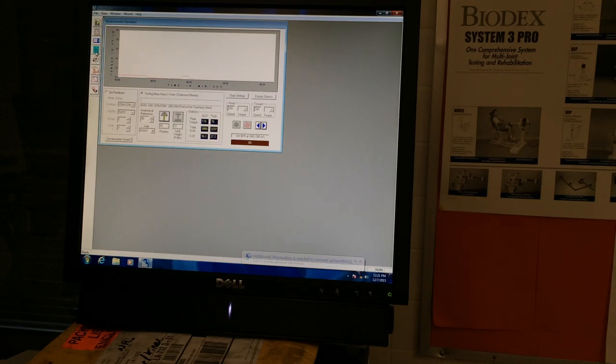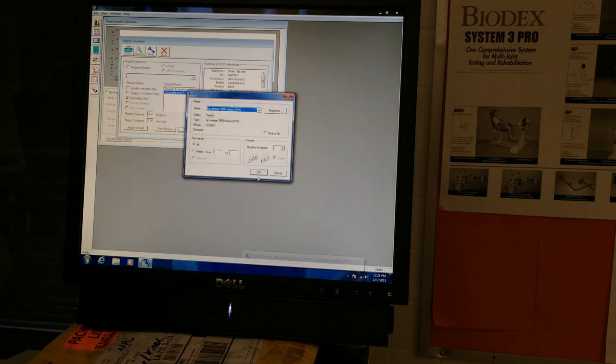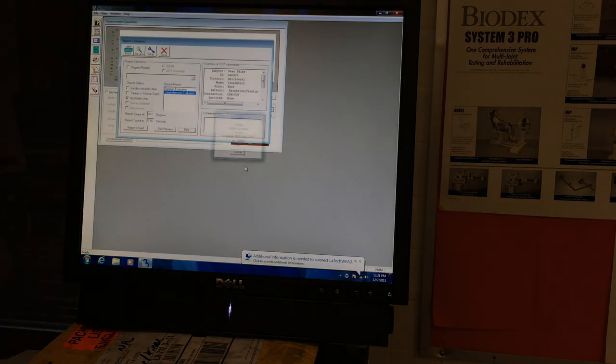And the last thing we do is we go to the little blue thing that says report. We click report. What we'll do is we'll go to comprehensive evaluation. And then depending on what you need, you can either use the metric or the normal units. We'll use the metric since this is science. Make sure that comprehensive evaluation is checked. Just hit print, hit okay. That'll generate the report from the printer.